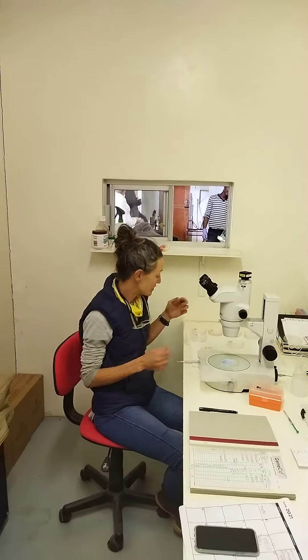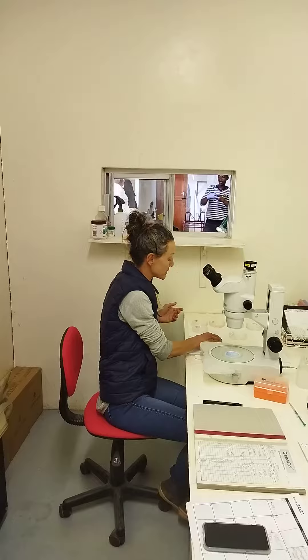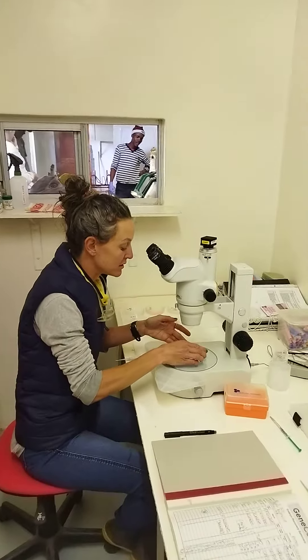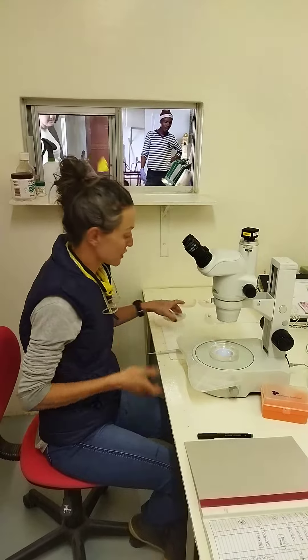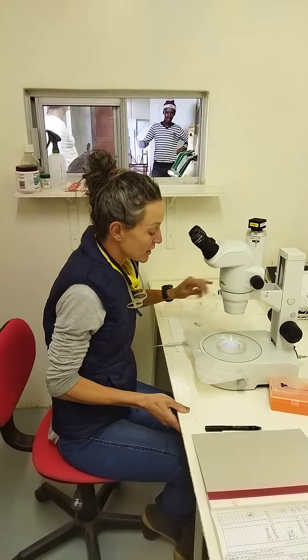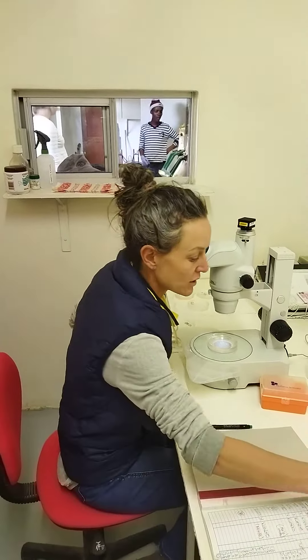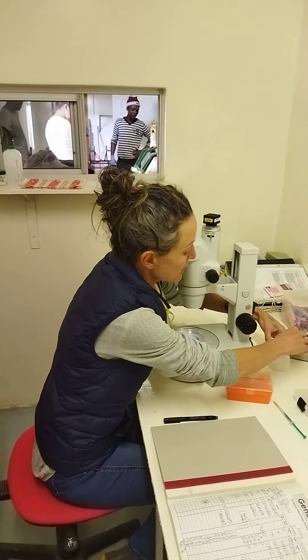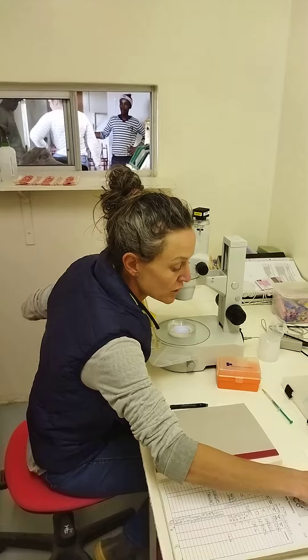Once the embryos have been flushed, France uses a specific media that we flush them in. We then go through with the microscope to find them — they're a bit too small to see with the normal eye. Once they've been flushed, they go into a special media called holding media.